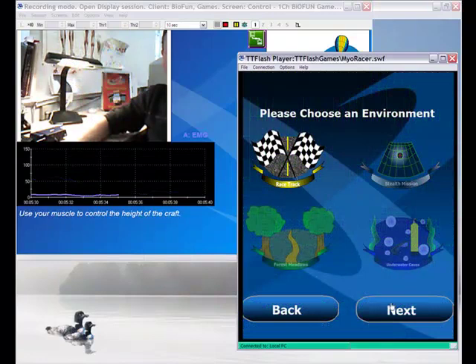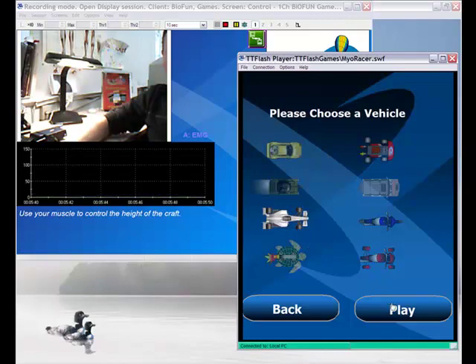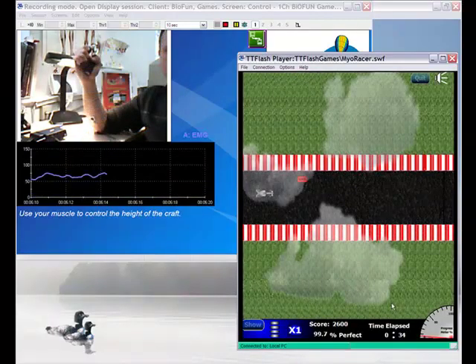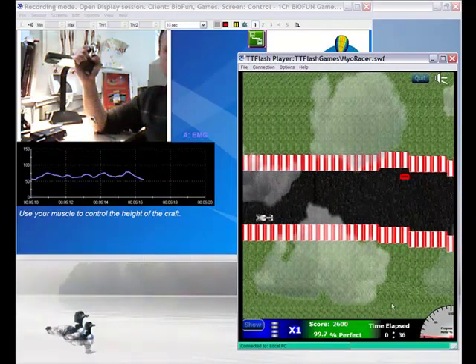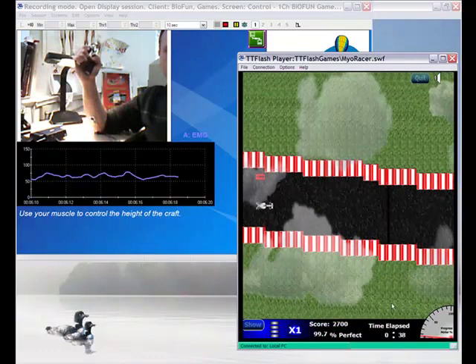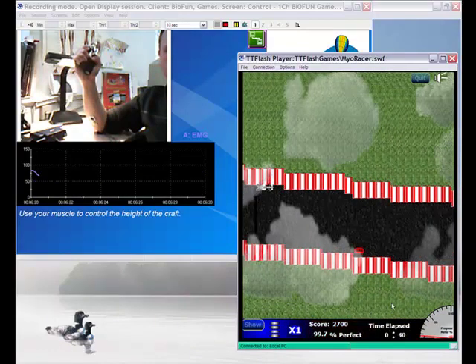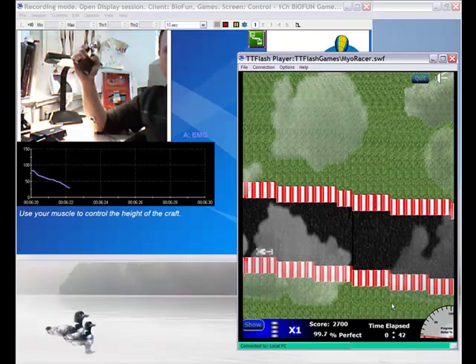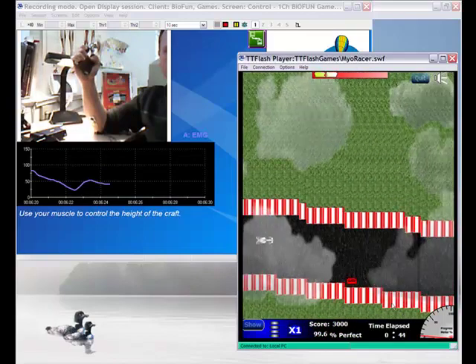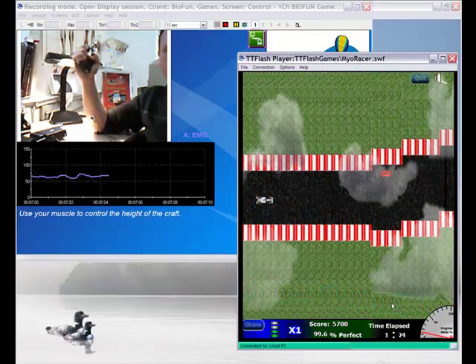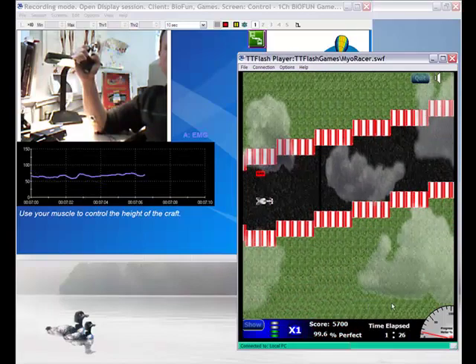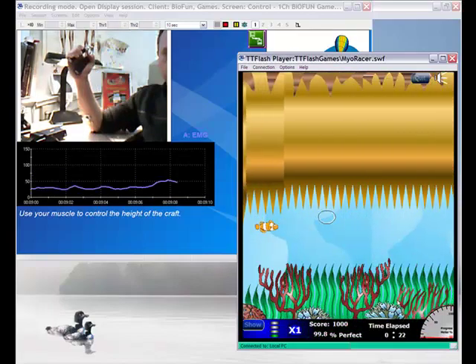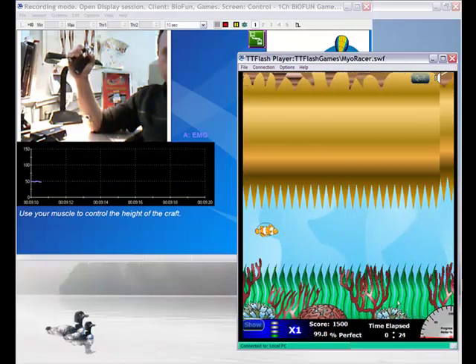We can use different environments. Another example is the racetrack. Formula one. Here we go. And as you can see, it's the same goal. So you have to stay on the track. You can catch bonus items which are the gas tanks. Another example here is the fish in the cave.